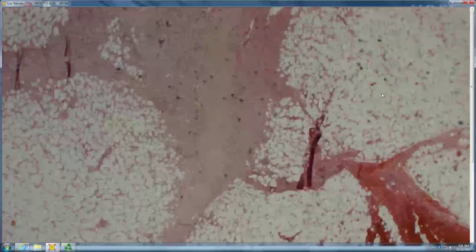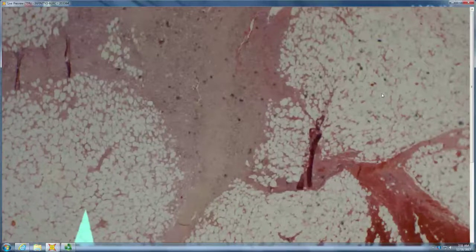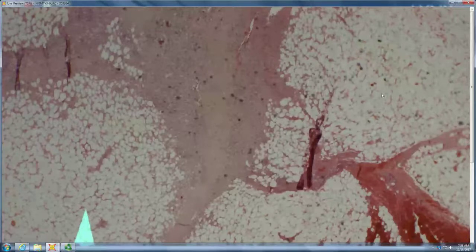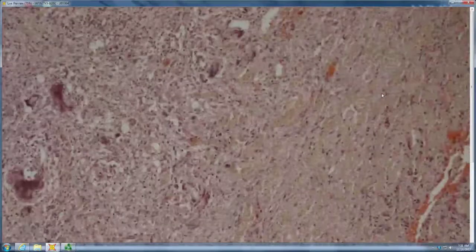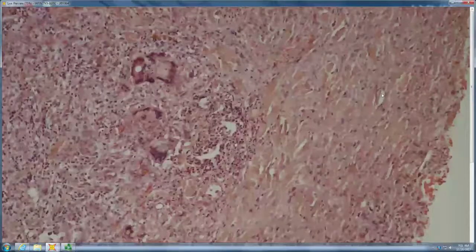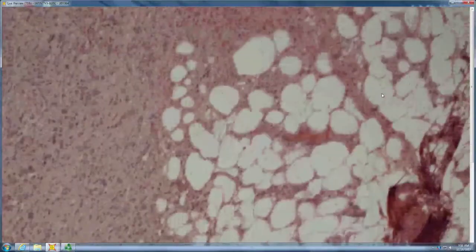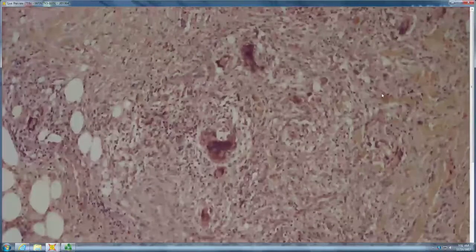It's predominantly septal. Predominantly septal. So even though it spills into the lobule, do you have a lot of lobular necrosis? Yeah. They all look like the same size. So probably EN. Yeah. And in EN, remember it starts neutrophilic, becomes granulomatous, eventuates in fibrous. And when you look at your granulomas, you often have the ones where you get the little cleft in the granuloma. The so-called Miescher's granuloma. Don't see them in this one, but they don't have to be there. They're often there. It's a characteristic, but not a required finding.